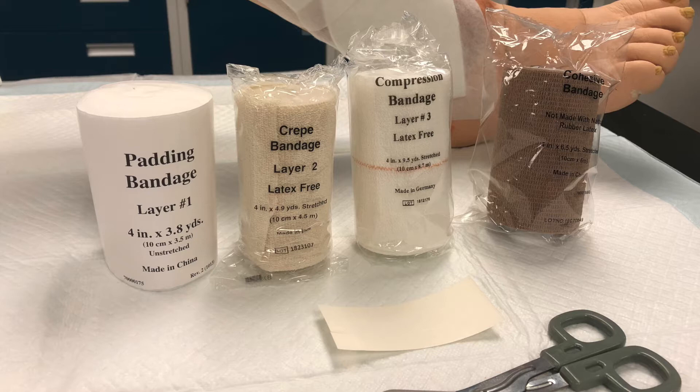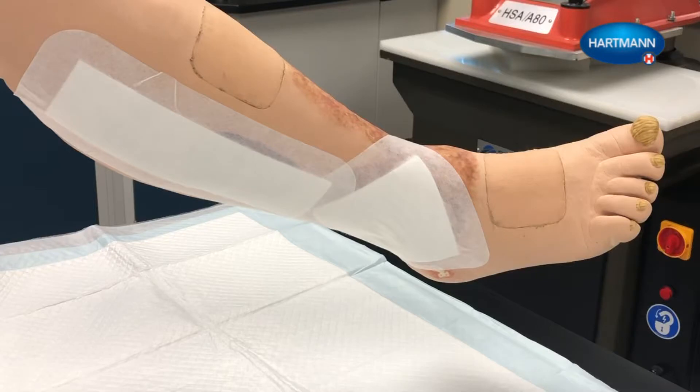ForePress should be applied by personnel that have received training on the proper application of the system. Before applying the first bandage, check the ABPI or Ankle Brachial Pressure Index using Doppler ultrasound to determine if arterial disease is present. If the ABPI is less than 0.8, do not apply the system.